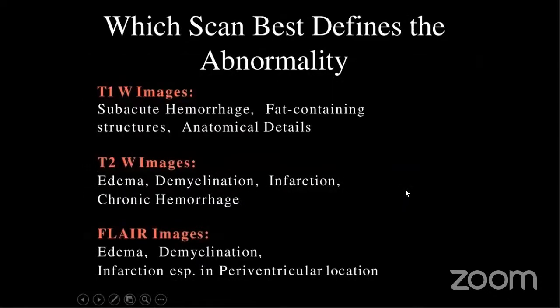Right. Which scan best defines the abnormality? That again depends on the pathology. So each sequence is important. Never give a pathology or come to a final diagnosis with one sequence, because all sequences are important. Each of them complements the others.